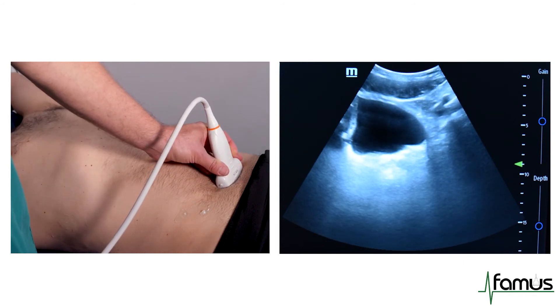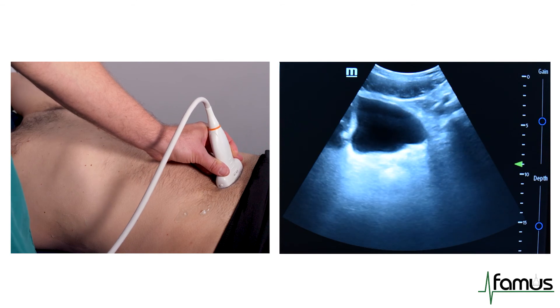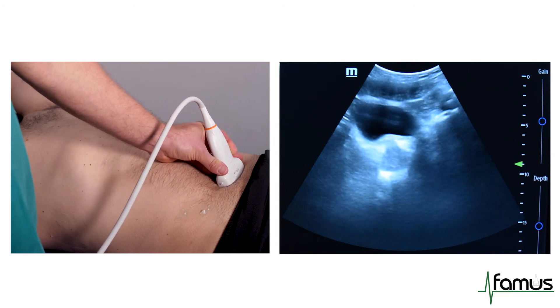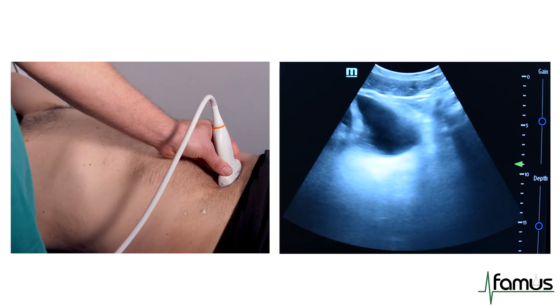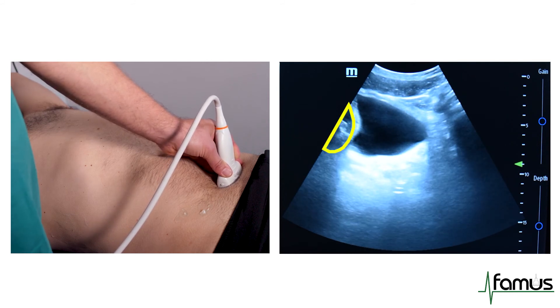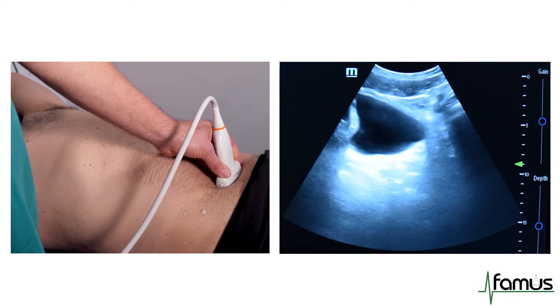We will scan our bladder firstly in the transverse view with the marker dot towards the right hand side, and we will turn our probe all the way through the bladder to see where the bladder has the largest volume. We will check for free fluid behind the bladder. In this case, there is no free fluid.